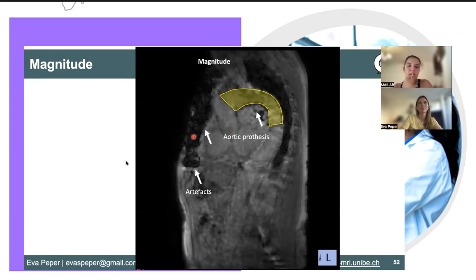And one more question. Since you talked about the spatial resolution, and since I'm on the low field MRI side of things, is there a specific magnetic field strength required to do 4D flow? Well, you can do it. I did it also on 7T ones. It was actually quite straightforward. I think the problem is really the SNR problem, right? At low field, it's also possible, but you just have to compensate for the loss of SNR.